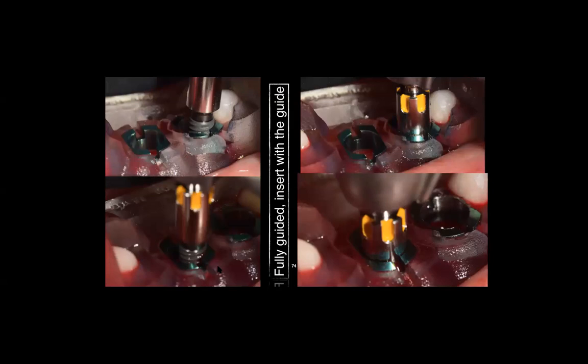Now, another thing I want to tell you about the guide is please do not hesitate to remove it. Don't put all your trust in the guide. Don't hesitate to look at the parallel pin inside the bone. Don't hesitate to move the soft tissue to see what's going on, to verify yourself. But you need to do that once, and once you do it and you're happy, then you could continue. But don't just wash your hands and say, I have a guide, it's going to take me home every single time, because sometimes the guide is not what you thought it would be.